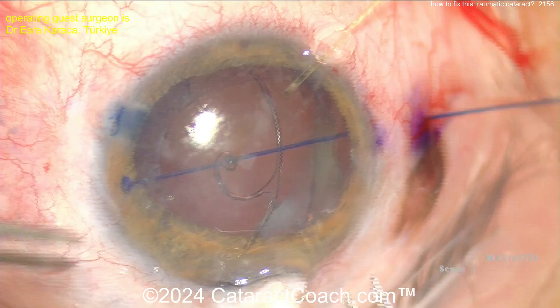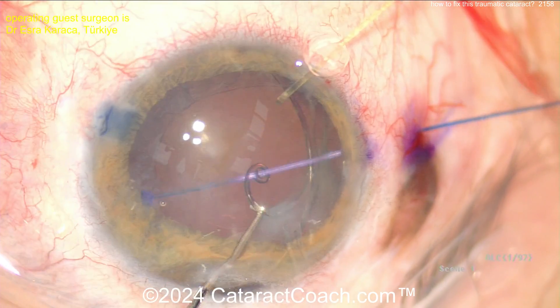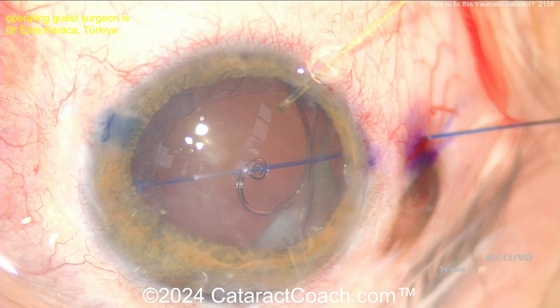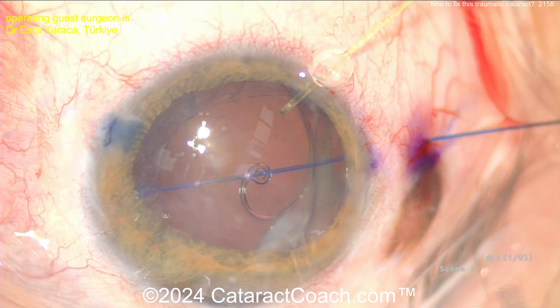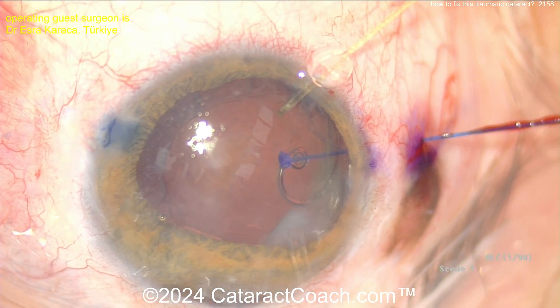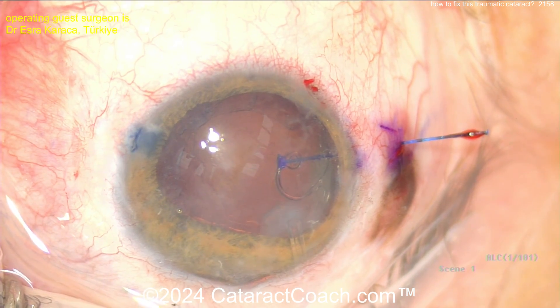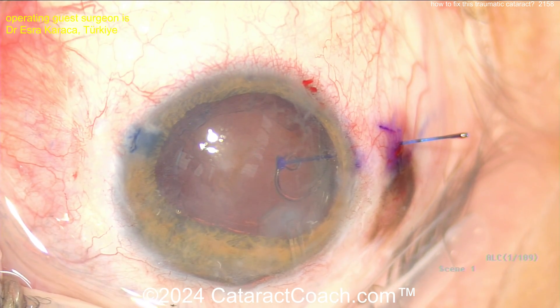Here it goes in the eye like the big CTR — the big Cionni ring. There's the extra little appendage going inside the eye. Beautifully placed, very nicely done. Now you can put a little bit more tension there on that blue prolene suture, pull that down, and get some good support and center this up.